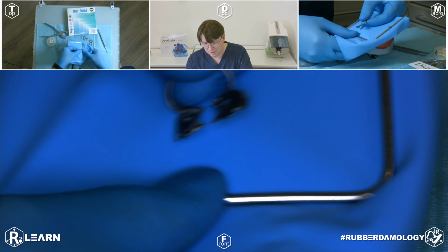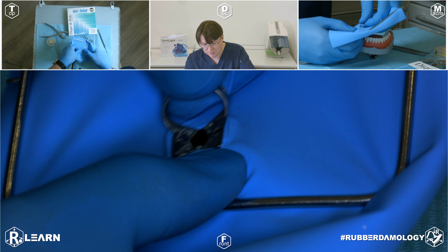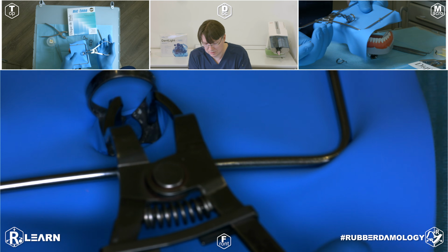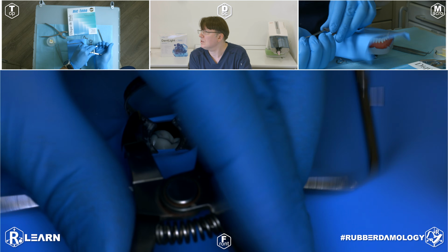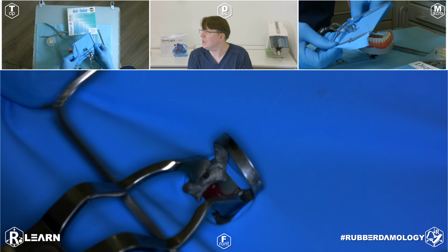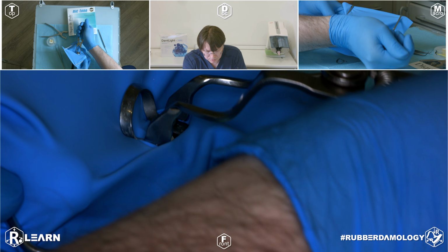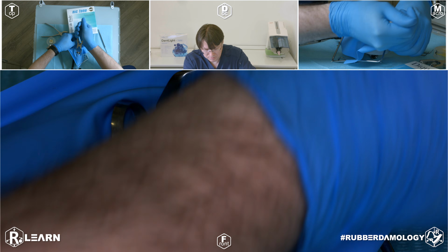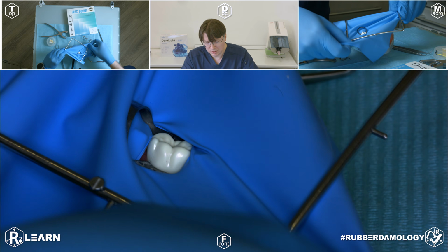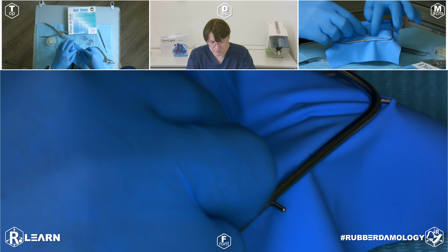Fix our clamp inside the perforation, and then fix inside this clamp the clamp forceps. Adjust the stopper, release two angles from the frame, insert in mouth and place on the tooth number 46. Release your instrument and fix your rubber dam. Very good.